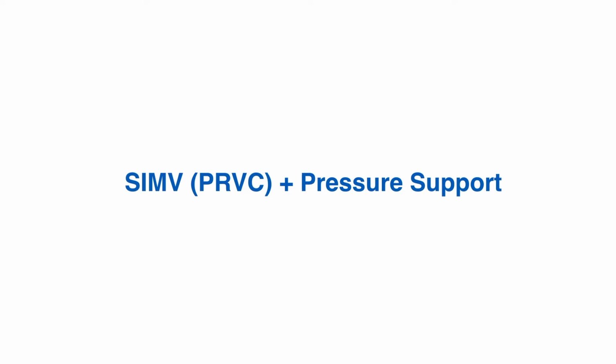So with pressure control, you give a fixed pressure for the duration of the inspiratory time, and the tidal volume varies depending on the compliance. In this mode, the tidal volume set is constant, and whatever pressure it generates varies from breath to breath depending on the compliance of the lungs. But the big advantage of this mode is that the ventilation is guaranteed. So the ventilator will put the pressure up and down to deliver the set tidal volume at the set number of breaths per minute. So your minute ventilation is guaranteed.